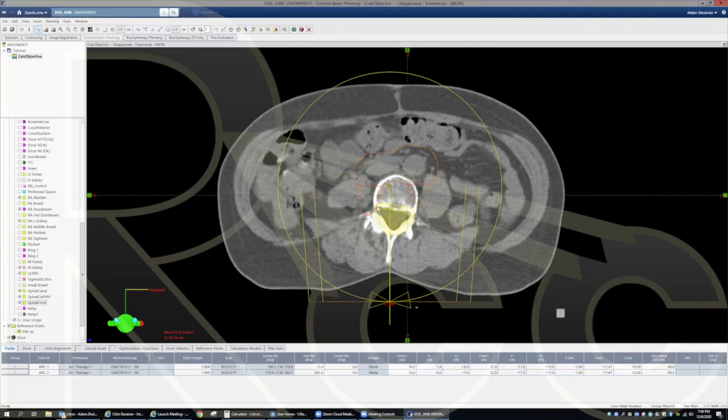So this is of particular importance for things like head and neck cases. I'll ask questions on a lot of the organs at risk every single time. So at the institutions where I've worked, I've tried to ensure that we have some sort of priorities on dose objectives. So typically in something like a head and neck, the optics would be spared, the brainstem and spinal cord spared as first priority. Second priority would be coverage of PTVs. Then third priority would be other organs at risk. And then if the doctor wanted to deviate, the doctor would need to put a note.